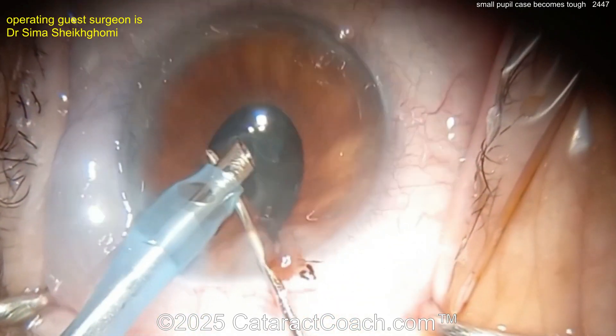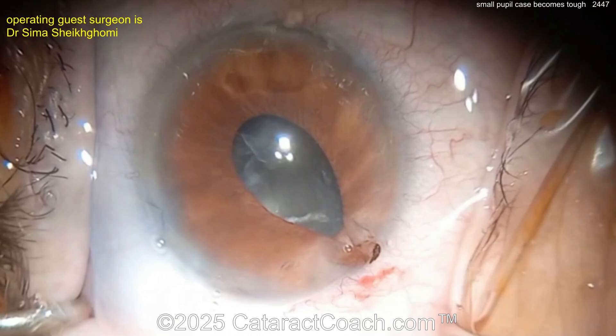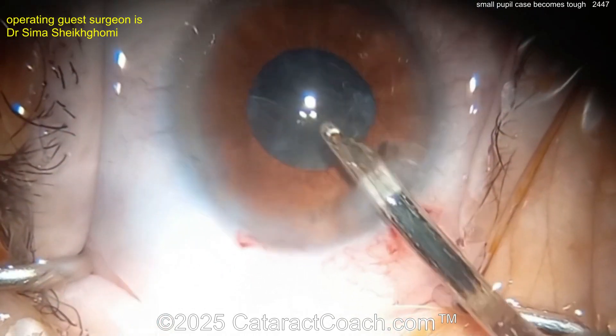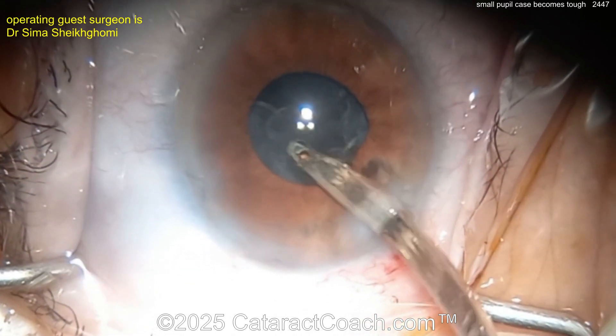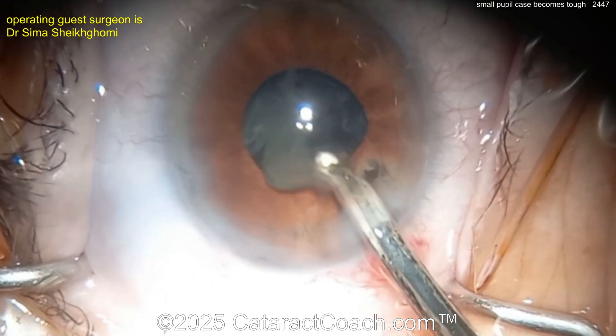The surgeon is going to power through and finish up the case — obviously great dexterity here. Able to open up the pupil by lifting it with the chopper. Now going with a Simcoe cannula through that extra side port. Good — you're cleaning everything up, and the patient is going to have a nice outcome.